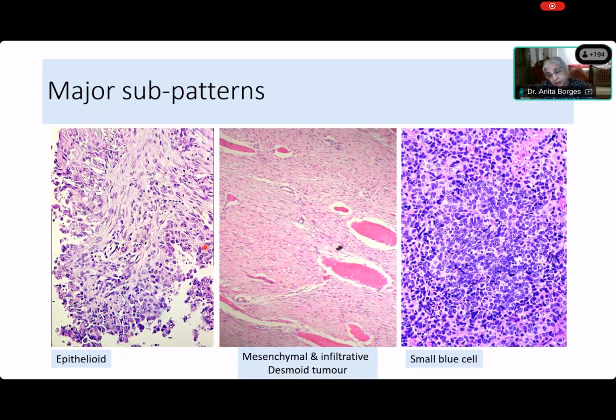And you know what that epithelioid tumor turned out to be? It was a gastrointestinal stromal tumor. Okay? We had to do immunohistochemistry to prove it. It was a retroperitoneal mass. And what was the small blue cell tumor? What did it turn out to be? It's a small cell carcinoma. Yes. But whatever you might do, it was only an educated guess. There was no differentiation.